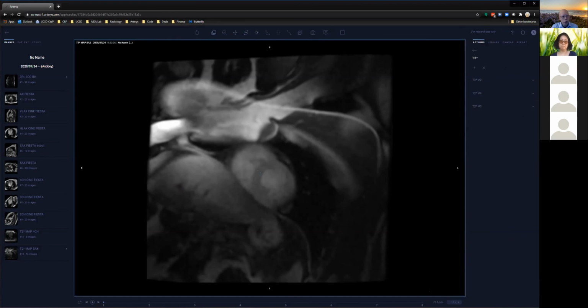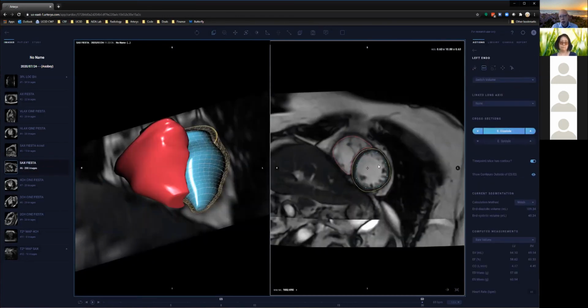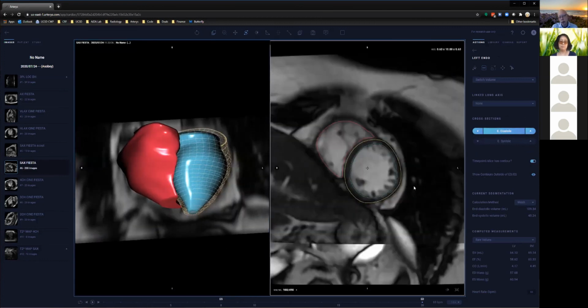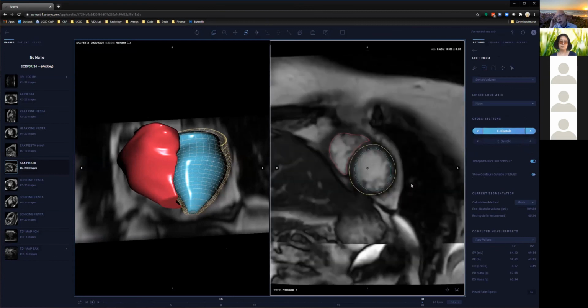For cardiac function, a lot of companies now have basically AI types of segmentations, so I don't spend a lot of time doing these. I usually read a couple of these on my own without a fellow because it's faster.